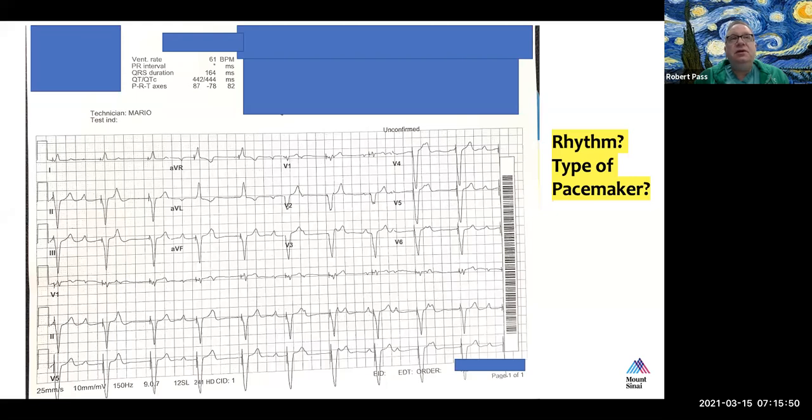How is this decision made? Why would we put in a single chamber or a dual chamber? So let's start again with the example I gave. A patient who has an arterial switch operation, has good ventricular function, otherwise excellent repair, but is in complete heart block. Does this patient need a dual chamber pacemaker? Is a single chamber enough? How would you make this decision?